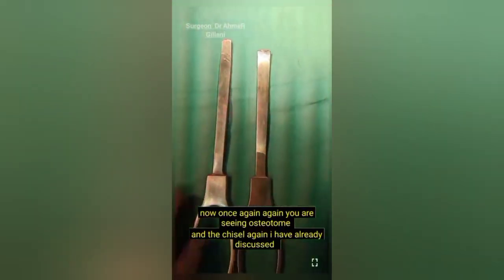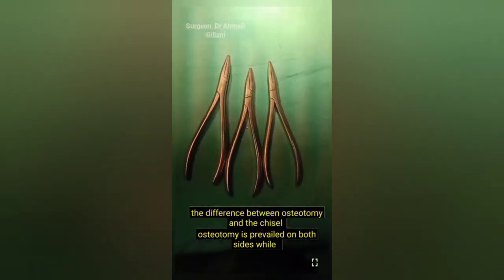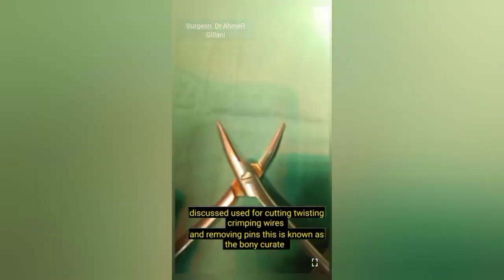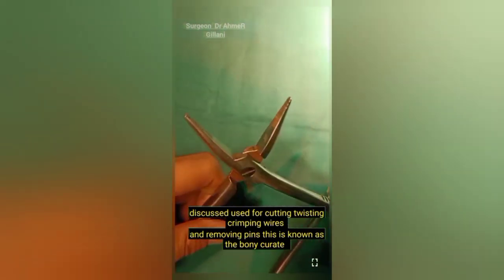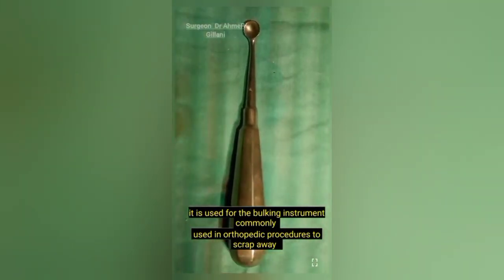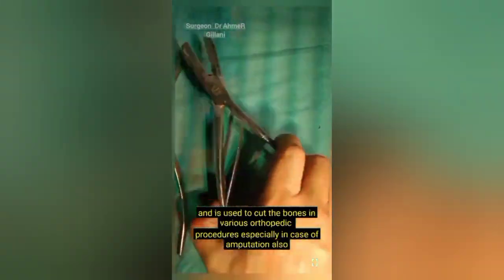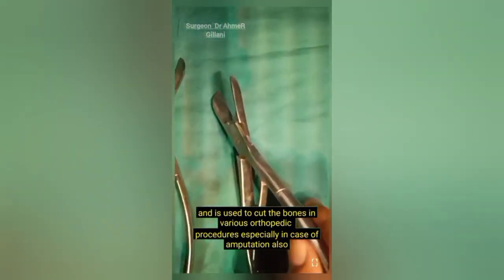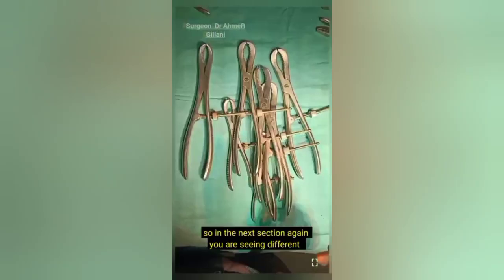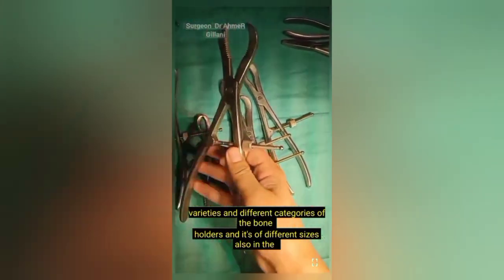Once again you are seeing the osteotome and chisel. The difference: the osteotome is beveled on both sides while the chisel is beveled on one side. Again you are seeing the different types of pliers used for cutting, twisting, and crimping wires and removing pins. The bone curette is a debulking instrument commonly used in orthopedic procedures to scrape away and remove fibrous tissue. The bone cutter is used to cut bones in various orthopedic procedures, especially in cases of amputation. Different varieties and categories of bone holders of various sizes are also visible.